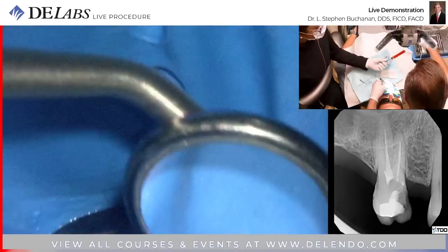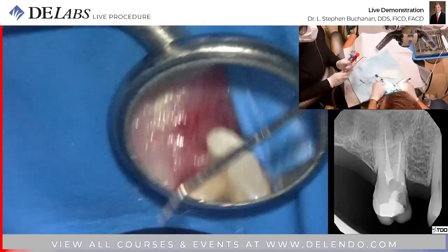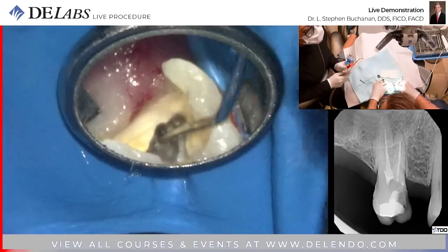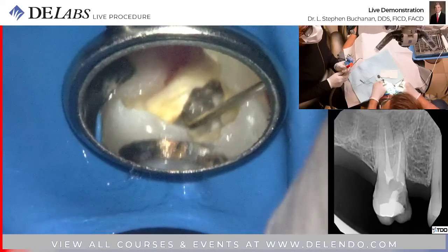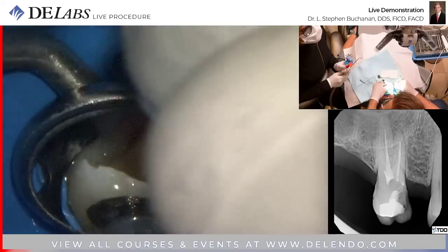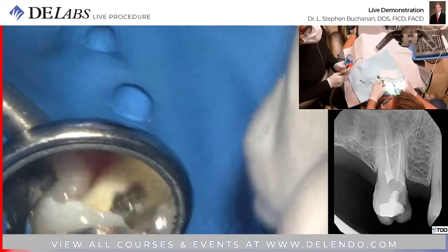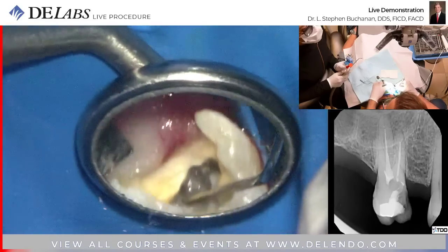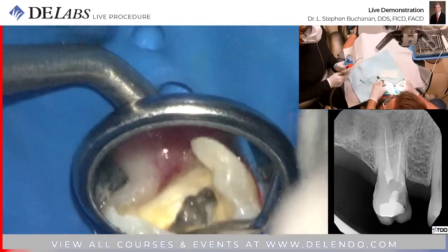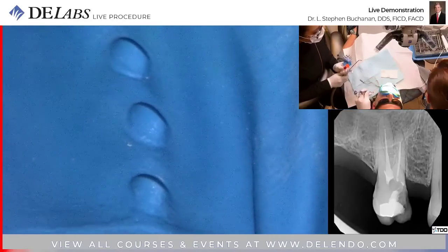Let me just see if there's another spot for another MB canal. That's one. Well, I'm getting tug back. Let's see if a rotary 15.06 wants to go in there.